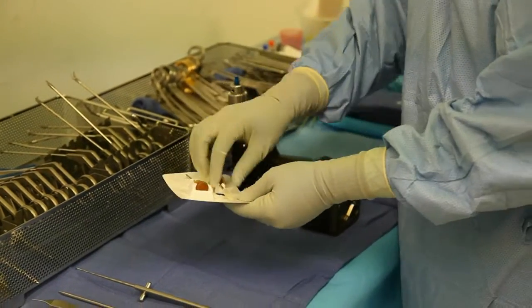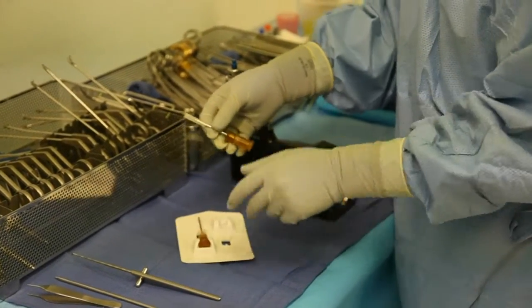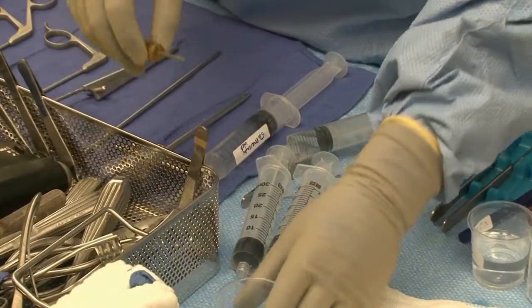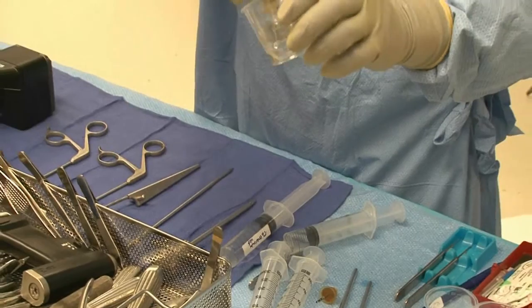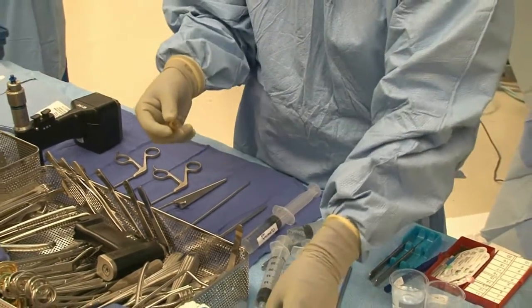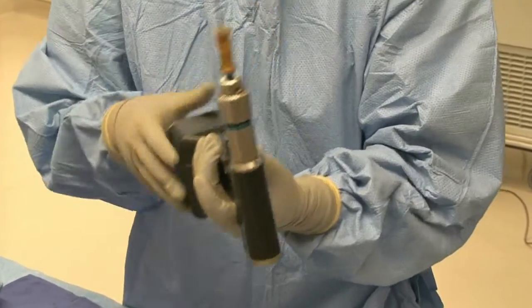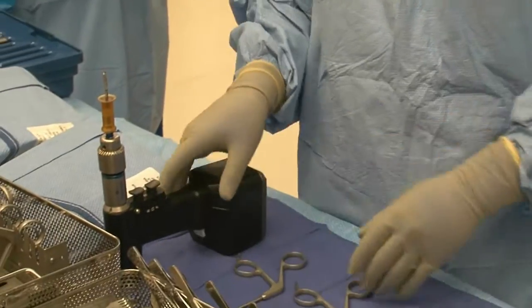Step 2. Leaving the Biomac catheter assembly intact, carefully remove the protective cap and thoroughly coat the catheter shaft with 3 to 5 cc of anticoagulant. Then securely attach the Biomac catheter assembly to the drill adapter on the drill.